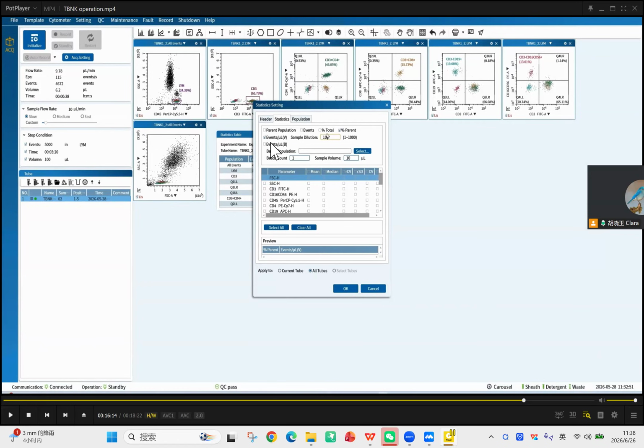You know, we can do this cell counting, to get the cell count information. There are two ways. One way is like the hematology analyzer, which directly gets the volumes. And now you have to put in the sample dilution.